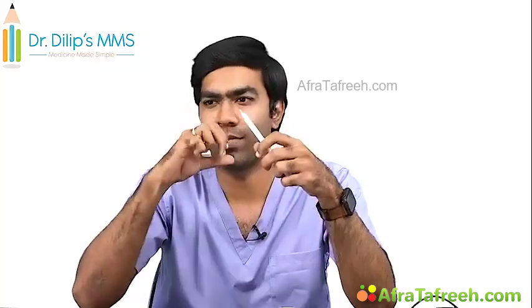Simple. You have a face mask and you have an oxygen tubing connected to it. Just pull the oxygen tubing out, and where you removed it there will be a hole, isn't it? Through that you connect a reservoir. That's it. And in the reservoir you connect the oxygen. That's all. This becomes a partial rebreather. Simple. Just connect an extra reservoir to the face mask by pulling the oxygen tube out, and the oxygen tube will go to the reservoir now.